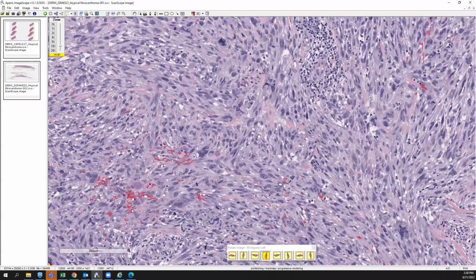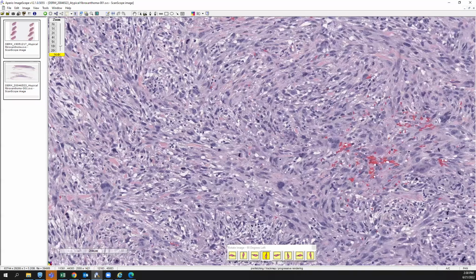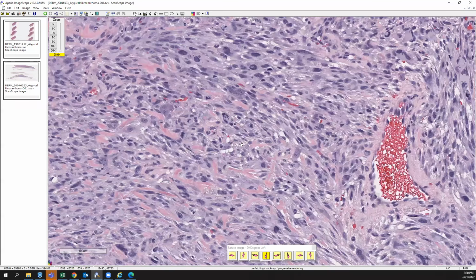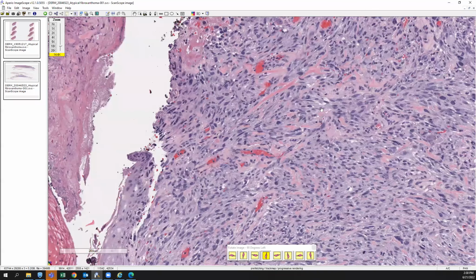ERG is kind of more preferred across various practitioners. So once you do all that and it's negative, you can pretty much sign it out, as I said, with that atypical spindle to epithelioid neoplasm, see comment, AFX fits, but also you'll want to correlate with the excision specimen.